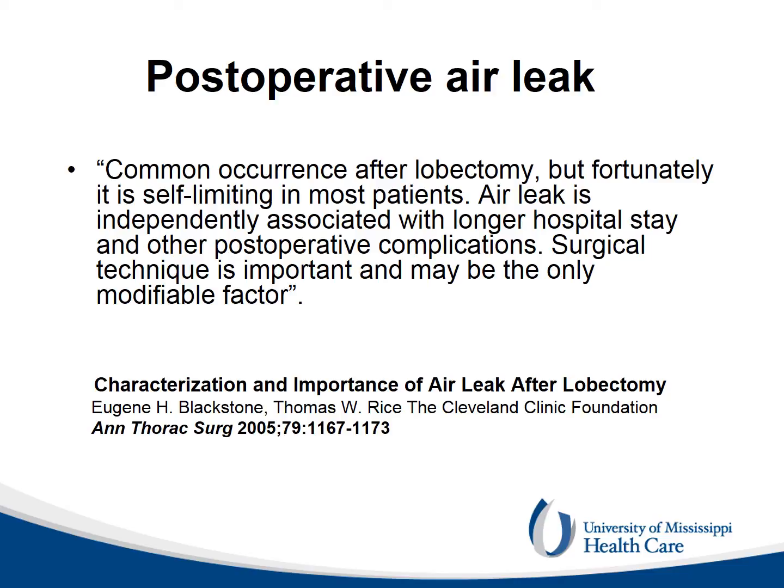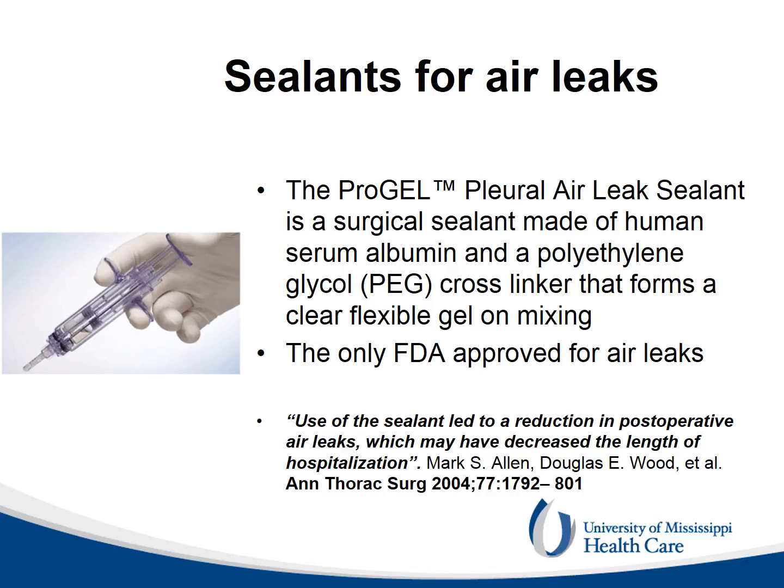A postoperative air leak tends to prolong the hospital stay, the patient discomfort, and the healthcare cost. At surgery, a meticulous technique may reduce its incidence. Progel is useful in reducing air leaks after lung surgery. It should be applied on surfaces as dry as possible in order to increase its adherence.